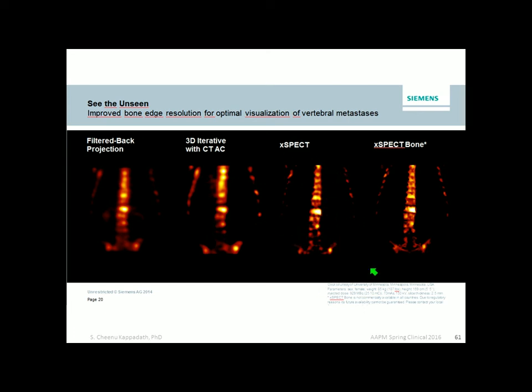It's called conjugate gradient methodology. But then here is the method I just described, where you're using the fact that CT is going to go to bone, so you can appreciate the changes in image quality, right? And so that's one of the things they're promoting. Our clinicians seem to like this, but it'll be interesting to see how the community responds to that, okay?